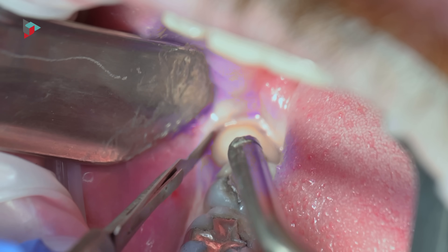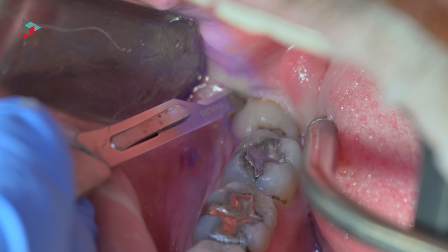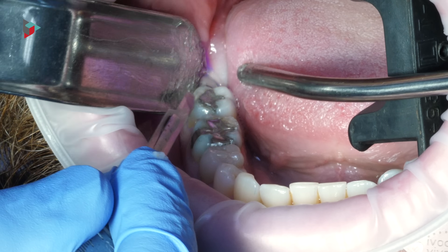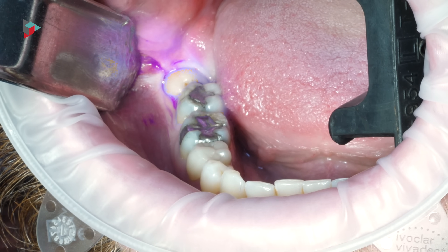We are looking at a good example of a tooth sectioning surgical procedure, and in this case it's used to remove this impacted wisdom tooth.